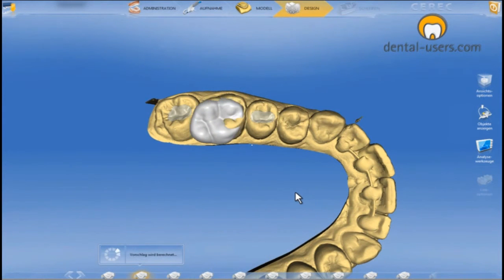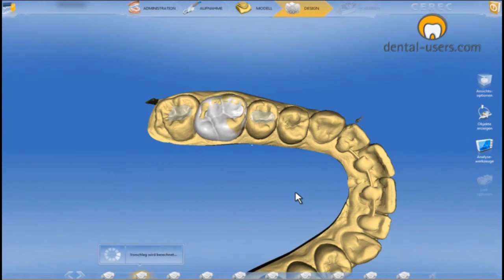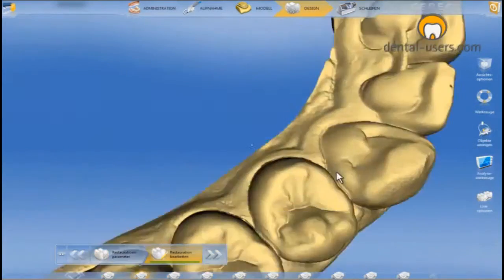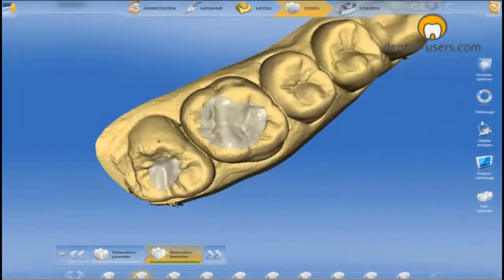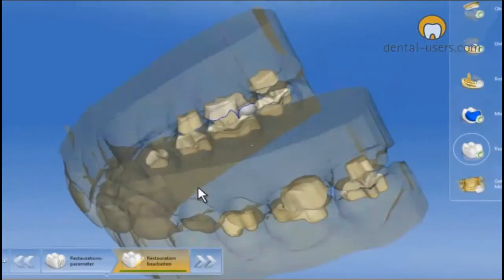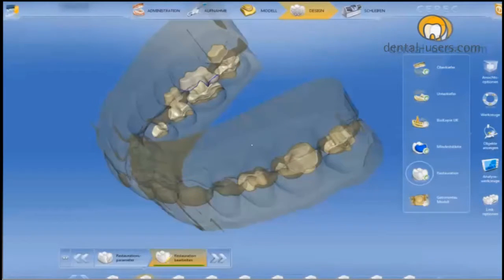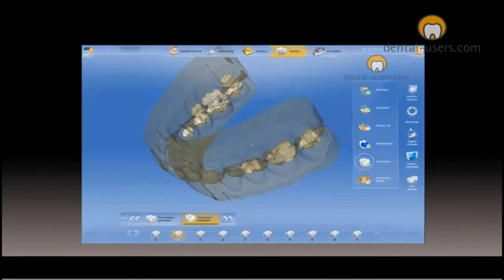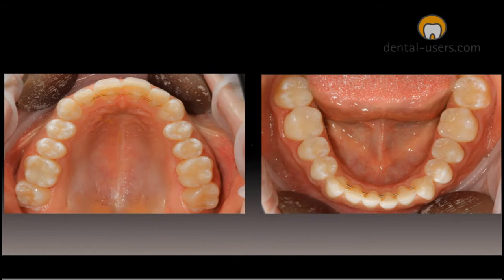Tooth 16 was left out, so we are going to start that one separately. The inlays were milled out of IPS Empress CAD and were fitted the same day. This is the situation afterwards.